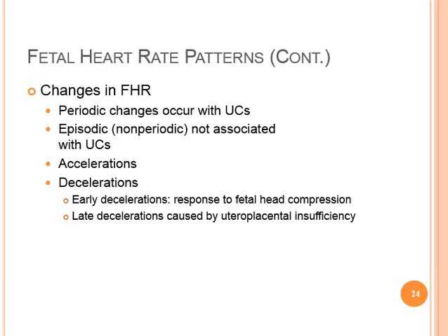Changes in fetal heart rate from the baseline are categorized as periodic or episodic. Periodic changes are those that occur with uterine contractions. Episodic changes are those that are not associated with uterine contractions. These changes include both accelerations and decelerations.